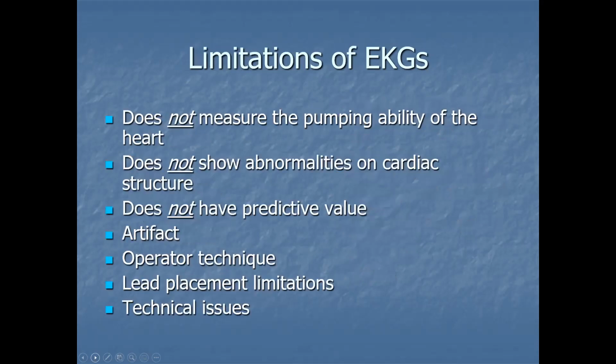Limitations. Like anything that we do, whether it's diagnostic or therapeutic or a combination, it has limitations. So the ECG or EKG does not measure the pumping ability of the heart. It measures the electrical activity. It does not show abnormalities in the structure itself. For something like that, you'd need a cardiac ultrasound or other procedures. For instance, going into the cardiac catheterization lab, where you could actually see some structural issues. It does not have predictive value in large part.